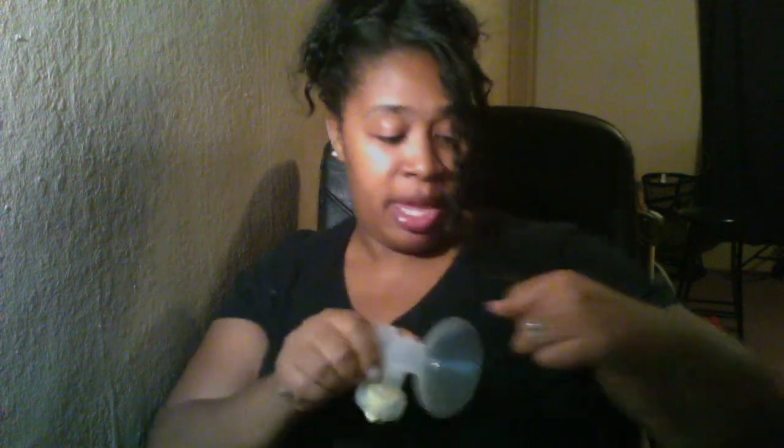You want it to be right underneath your breast. These pieces here adjust — adjust it to where you want it. You'll have it on just like this, right underneath your breast. You would adjust the straps to where you want it. Then you would get your cups for pumping and place them inside of there, just like so.